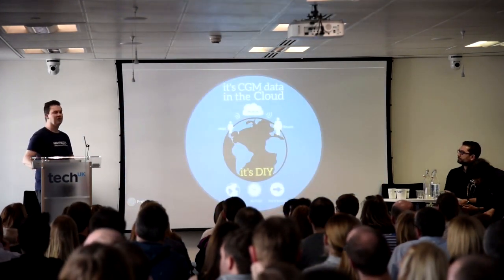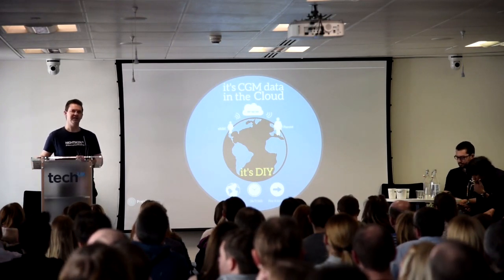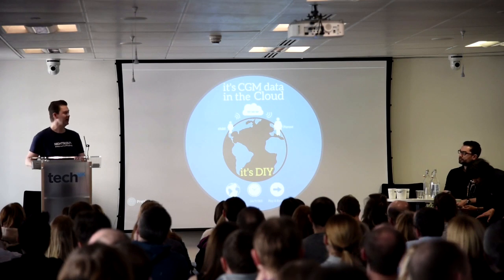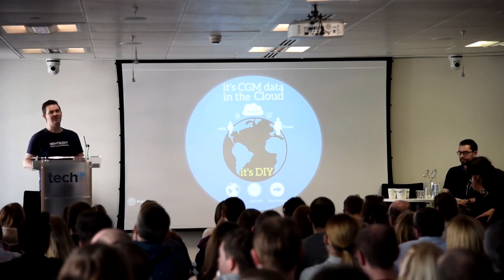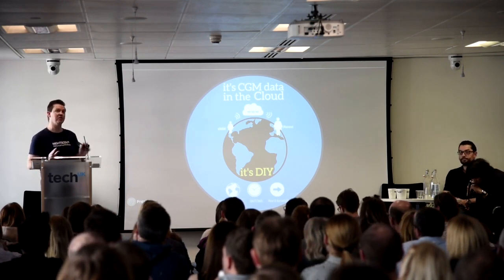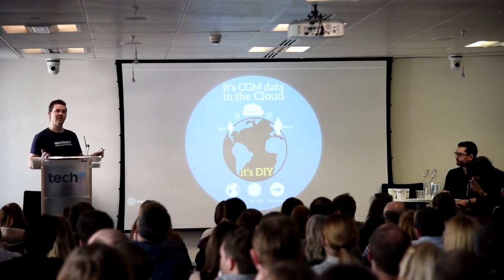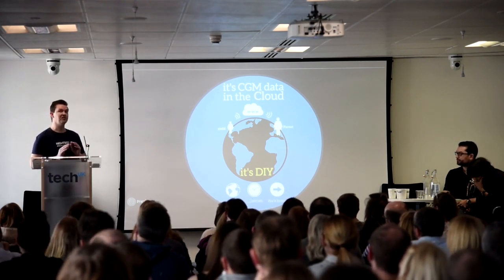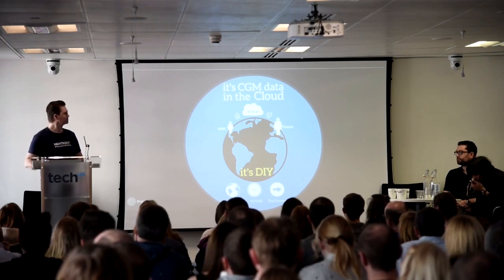Okay, so Nightscout then, and CGM in the cloud. It's all about getting CGM in the cloud, and it's born out of a parent wanting to see their child's glucose values. It's a DIY thing. If you ask any of us up here to build it for you, you'll get a resounding no. We will not do it for you. But as you can see at the bottom, with global support, it's around the world. It's pretty much 24/7. There are so many people to help you get where you want to be, if that's where you want to be.